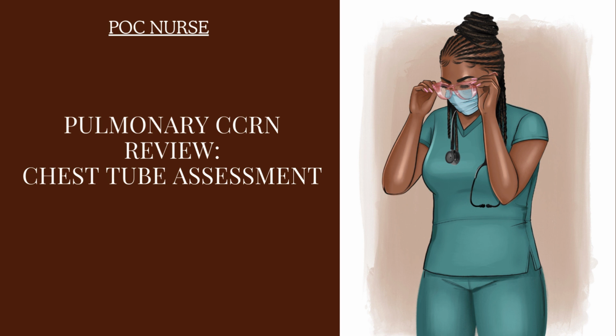Also, you could get bleeding into your Pleurovac, into the drainage box. If you feel like the patient is bleeding into the drainage box, there's bright red blood coming into the box, and you have 200 ml over an hour for at least 2 hours, you want to notify the provider. The patient might be bleeding inside and the patient might require surgery.